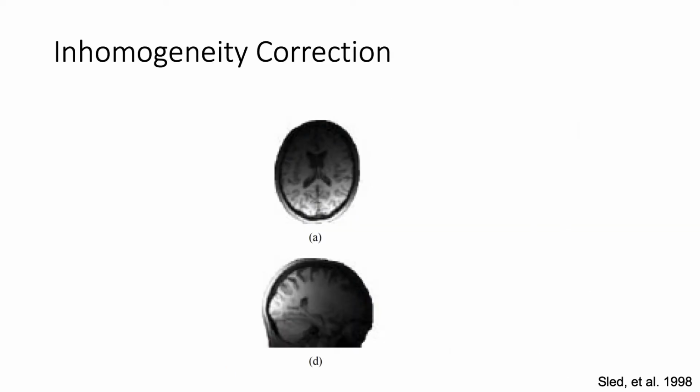And then the other issue is the intensities are different across different tissues and depending on the scan as well. So you fix the field map, or supposedly fix it. Now you still deal with intensities, and you can see in this image it's dark at the top of the brain and bright at the bottom of the brain. Well, you're going to have different intensities and signal to noise in these different areas, and so you want to adjust for that too.